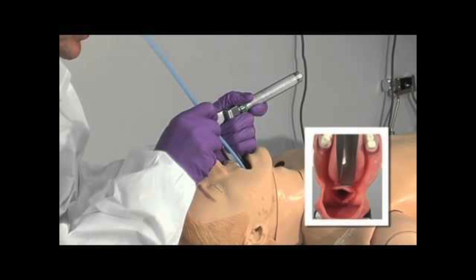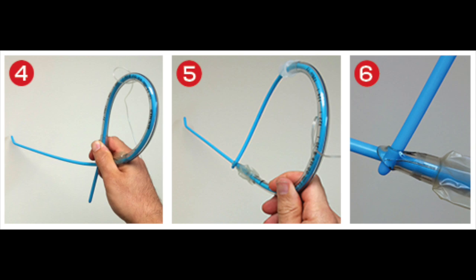In this next picture here, it talks about loading the bougie. This is from me to you. This is a personal preference. I don't care for this. If you like it, if you teach it, if that's how you roll, more power to you. Who am I to tell you how to intubate your patient? But to me, it defeats the purpose of how the bougie was designed. The bougie was designed for me to feel in my fingertips as I pass that bougie into the trachea and feel those cartilaginous rings. If I load it into an ET tube as it is here in this picture, to me it takes away that sensation. So what's the point? Why am I doing it? But that's just from me to you. If this is the way you do it, rock on. More power to you. As long as you get that tube in the right spot, I could care less where it is. So let's move on.